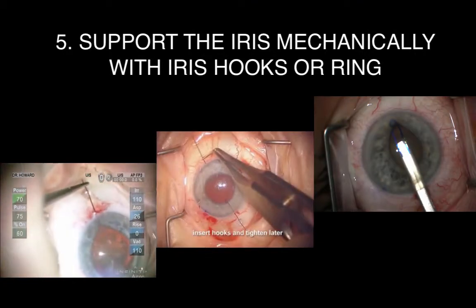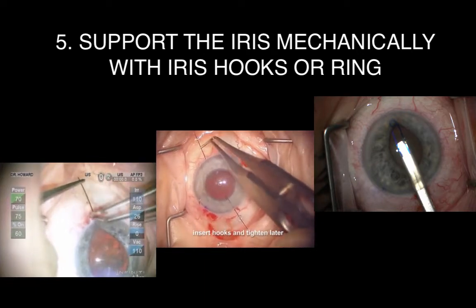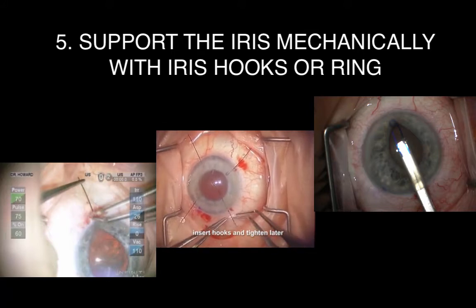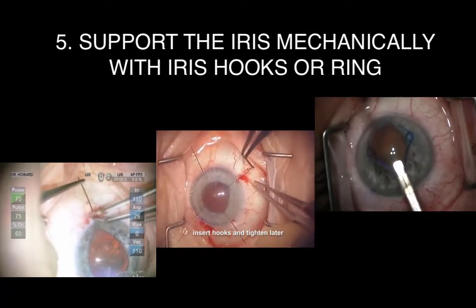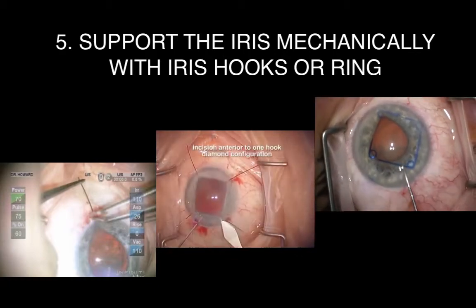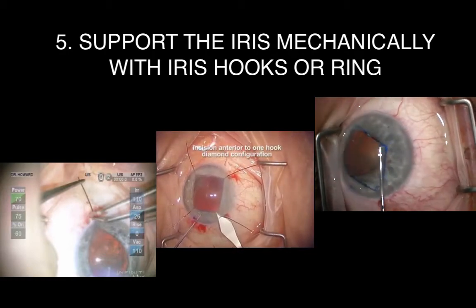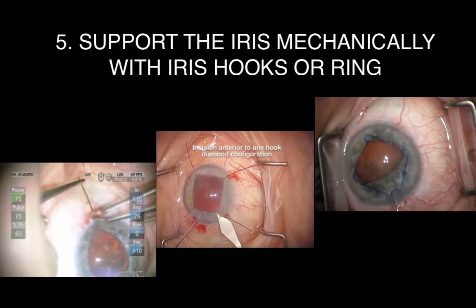Tip number five is to support the iris mechanically with iris hooks or with a ring stabilizer. This can be done by either placing a single iris hook posterior to the main wound, or by placing the hooks in a diamond configuration with one of the hooks posteriorly in a similar fashion. Alternatively, a Malyugin ring stabilizer can be used, as seen here. Mechanically supporting the iris is particularly helpful if you are concerned about possible intraoperative floppy iris syndrome.